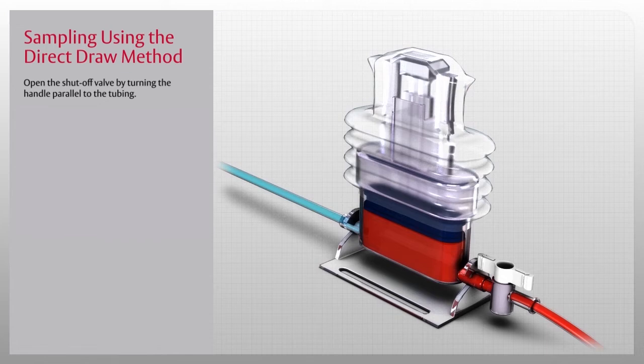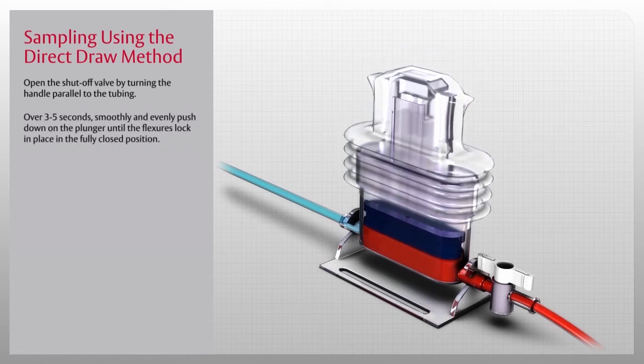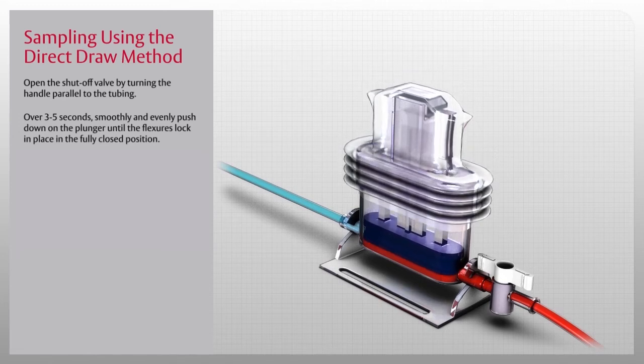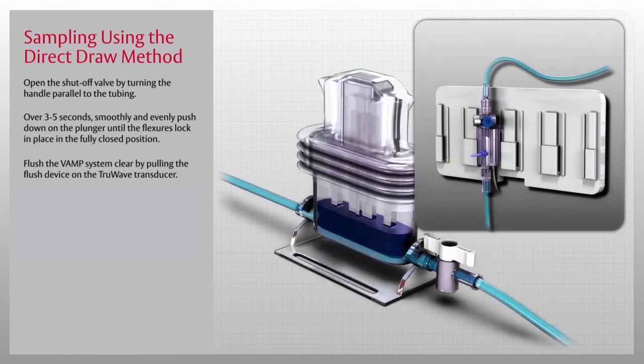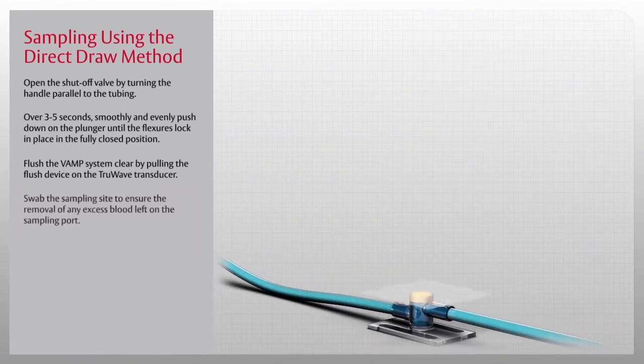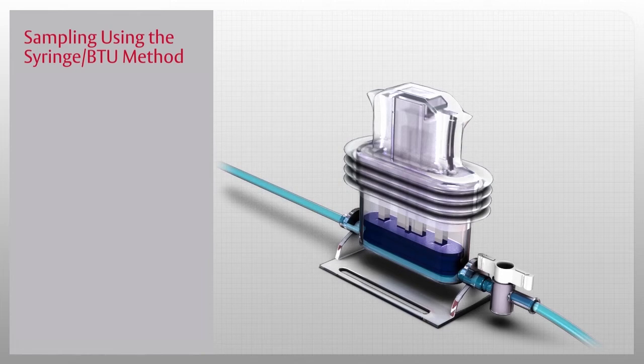To re-infuse the blood and clear the line, open the shutoff valve by turning the handle parallel to the tubing. Over three to five seconds, smoothly and evenly push down on the plunger until the flexures lock in place in the fully closed position and all of the fluid has been re-infused into the line. Finally, flush the VAMP system clear by pulling the flush device on the TrueWave transducer, and swab the sampling site to ensure removal of any excess blood left on the sampling port.